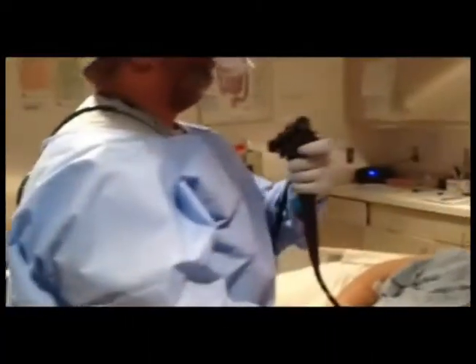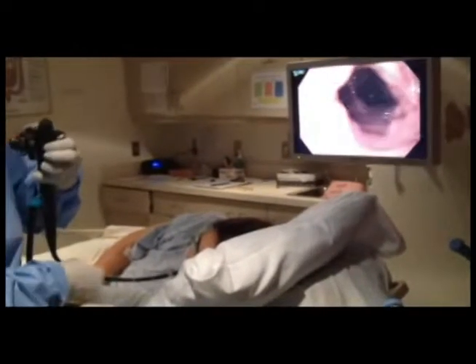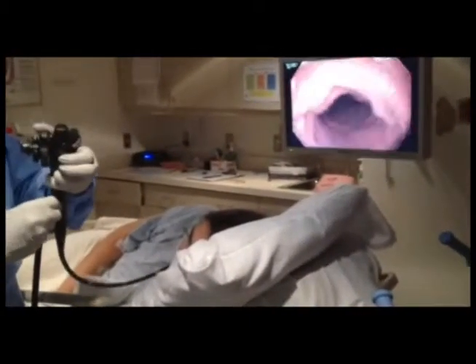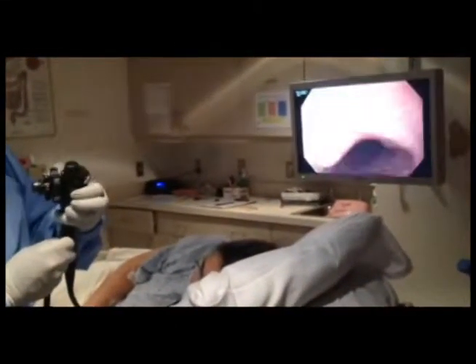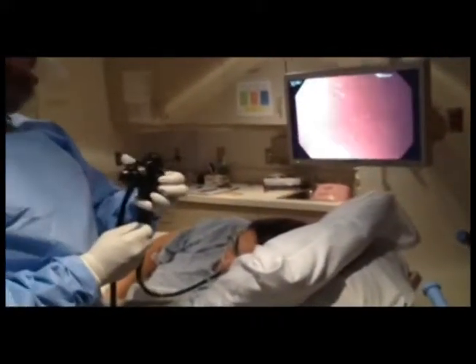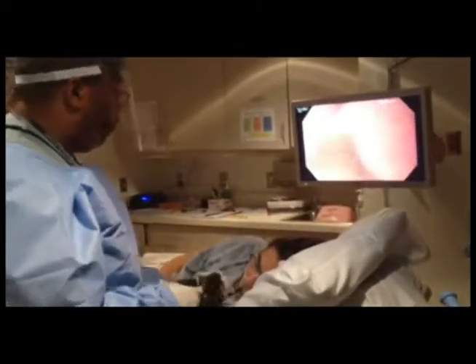This is a 45-minute collection and we have a fair amount of fluid. Looking back at the duodenum, we'll collect some more fluid. This is how the procedure is done — it's very easy, but it does take a little coordination with your nursing staff. The nurses really make it happen, and your laboratory personnel have to be able to run the analysis. We've published several manuscripts on the methodology for analyzing pancreatic juice using an auto-analyzer, either by Beckman or by Olympus. This is standard laboratory equipment that's available.